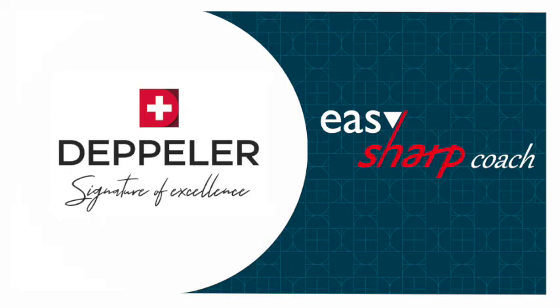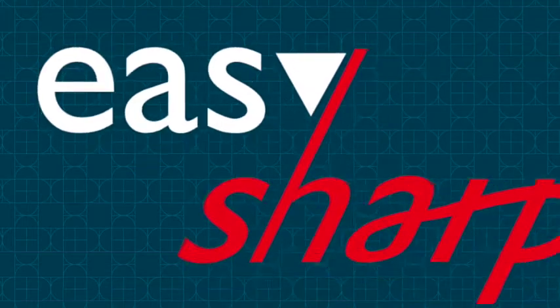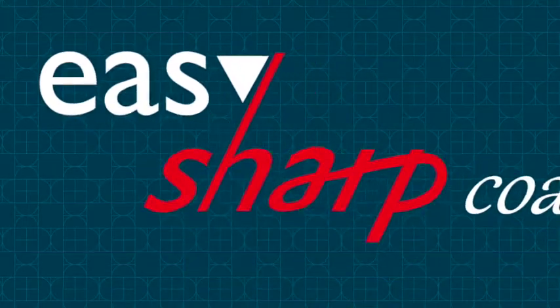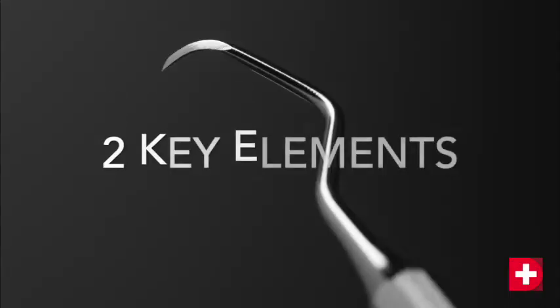The aim of this video is to teach you how to use the EasySharp Coach. It will also allow you to understand our method and to keep your instruments in perfect working order throughout their life cycle.